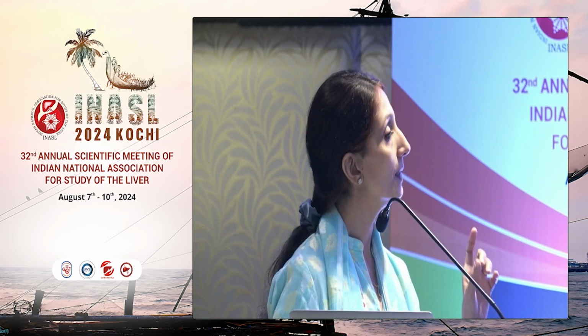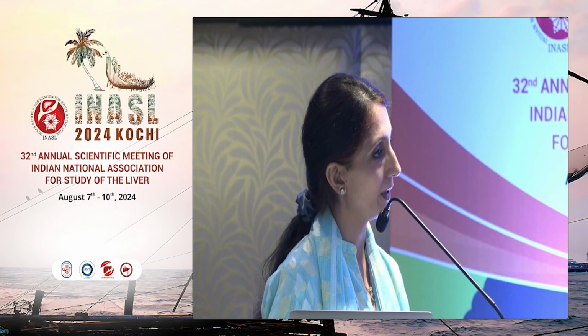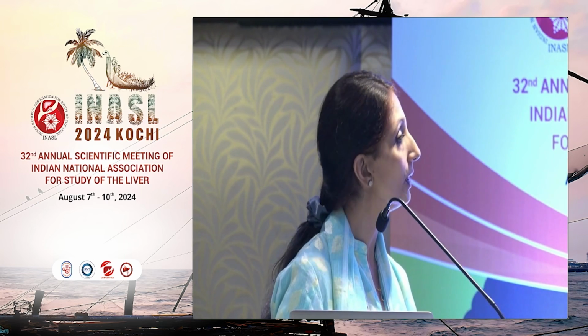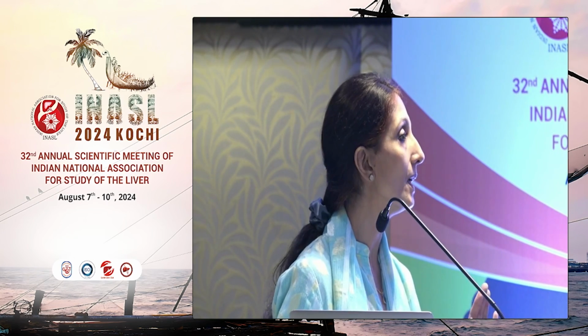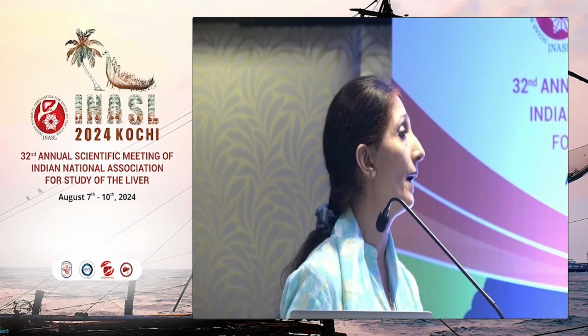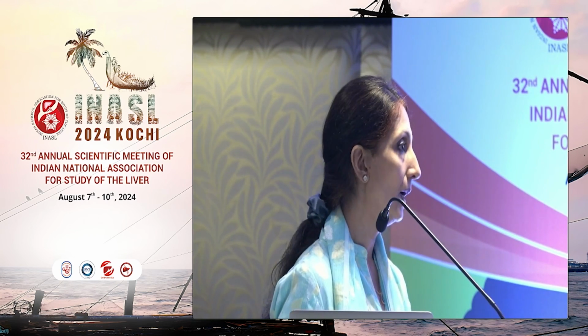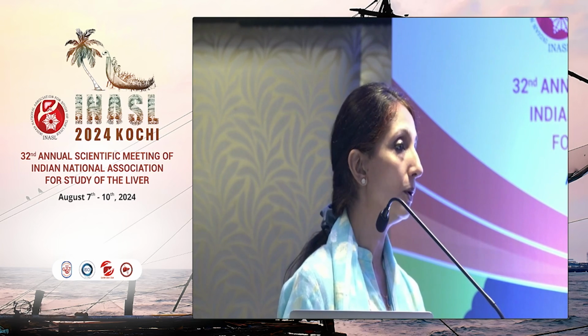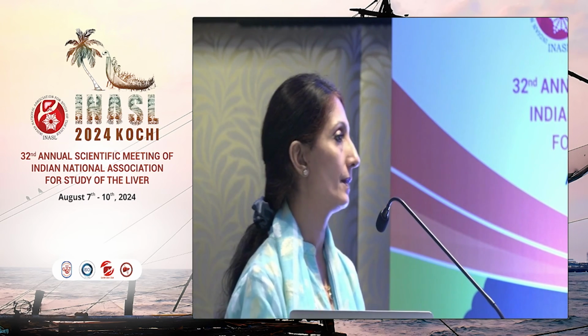The more experience you get, with one vial of 5 ml I can actually scan 3 patients. So it's a 6,000 rupee vial. I use it for 2,000 rupees per patient, and then I just charge a little bit for the ultrasound. So in a 2,500 rupee study, you can easily scan the patient and see whether the lesion has increased in size or there's a change in enhancement pattern or something happening there. And now we even have Sonazoid. We brought it in with a research agreement. So it's a very good modality to screen and for surveillance.